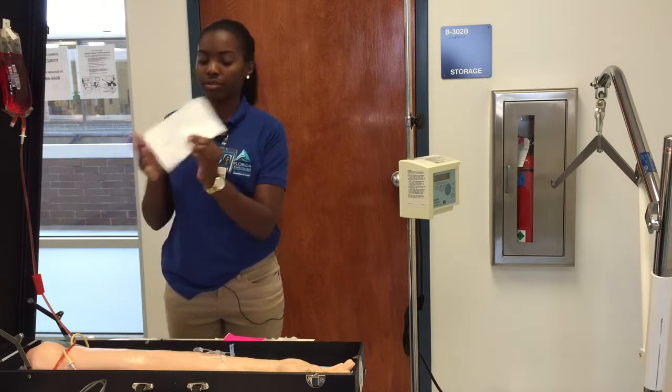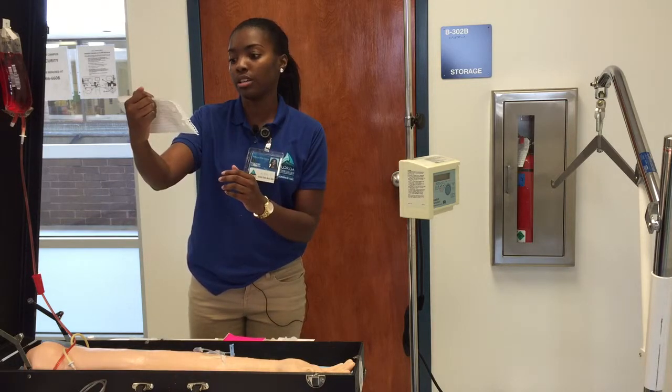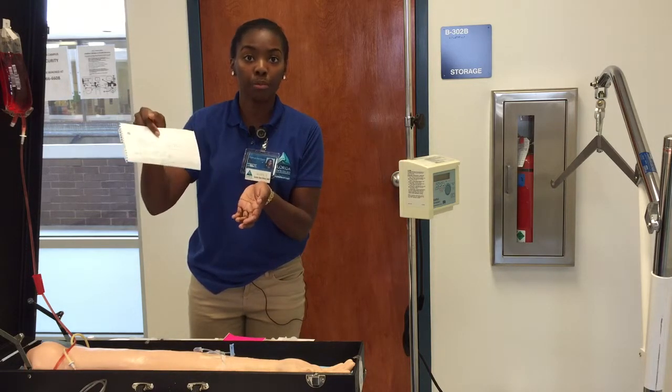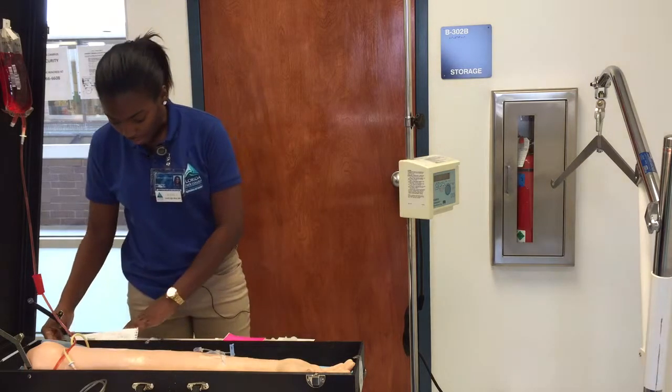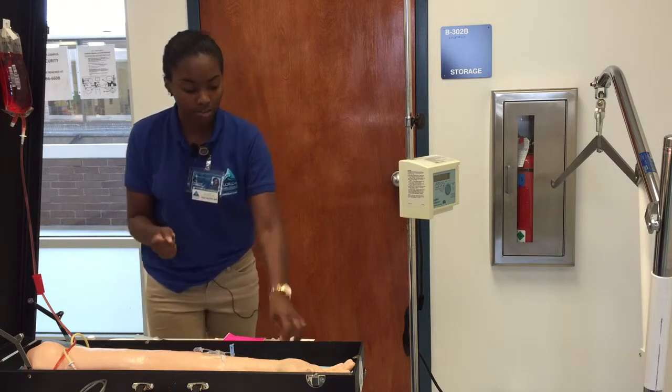And the drop factor is 10, and so the drop rate would be 8 drops per minute. And so now I would wash my hands and put on my gloves.